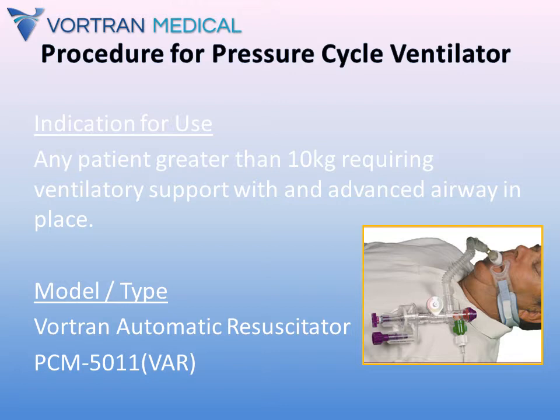This video will introduce various tools we can use to determine the efficacy of our efforts, review the basic chemical elements and compounds involved in respiration, show the need for keeping our patient properly hydrated during our efforts, and lastly, describe the VAR's basic controls. While I may introduce accepted values, this video is not intended to define or prescribe a specific treatment for any individual patient. Now let me give you a brief introduction into the VAR.